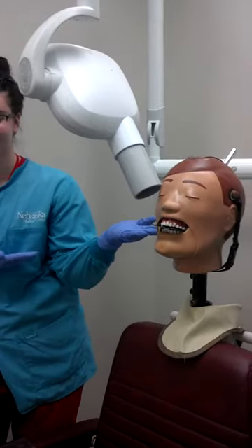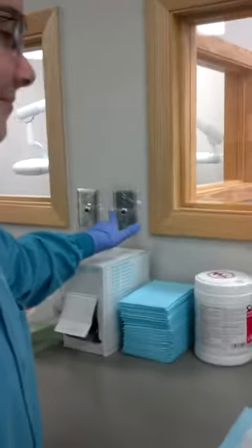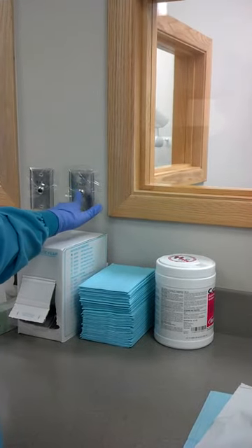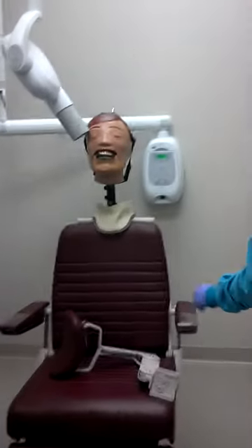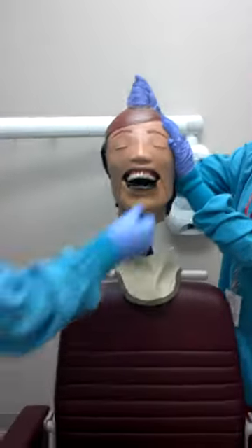When you are ready for the exposure, come back around to the countertop about 6 feet away from where the exposure is taking place. Press the exposure switch until you hear the beep. You can then go back to your patient and remove the plate from their mouth and remove the thyroid collar.